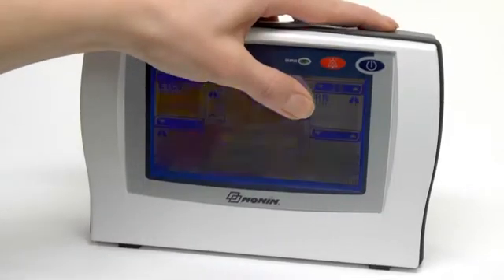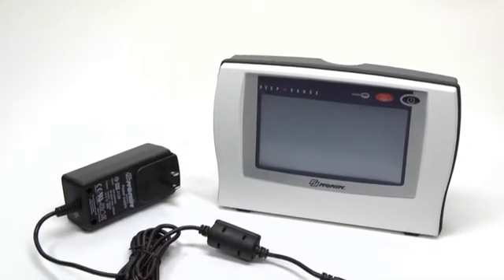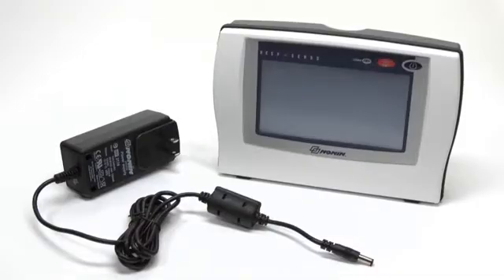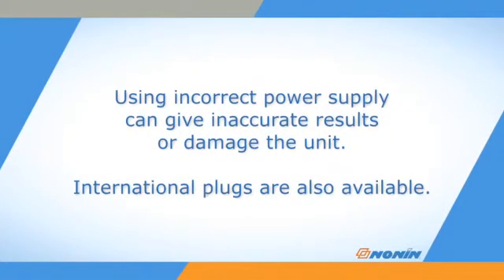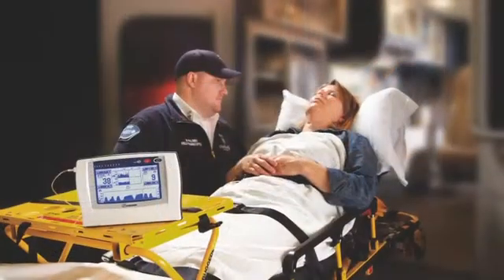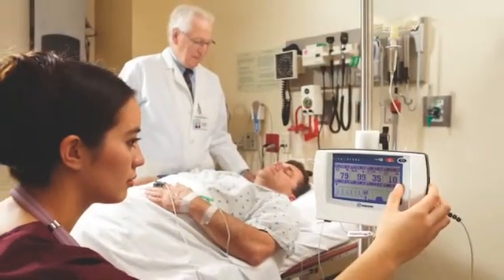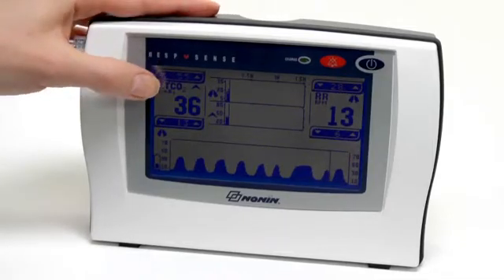The monitor has a wide touchscreen for easy programming and operation. It can be run with a provided power supply attached to standard AC wall power or an internal rechargeable battery pack. Using an incorrect power supply can give inaccurate results or damage the unit. The monitor is ideal for both stationary and mobile monitoring applications, as well as for continuous monitoring or spot checks.